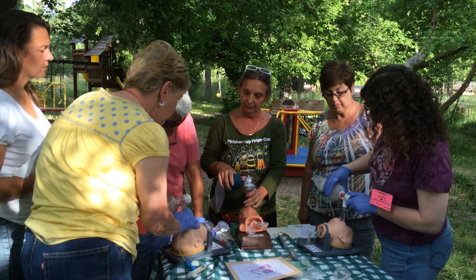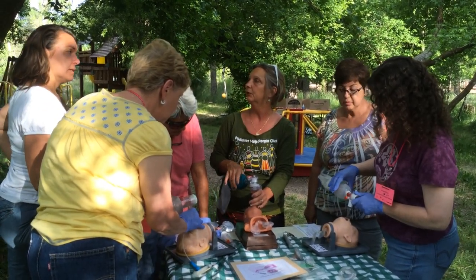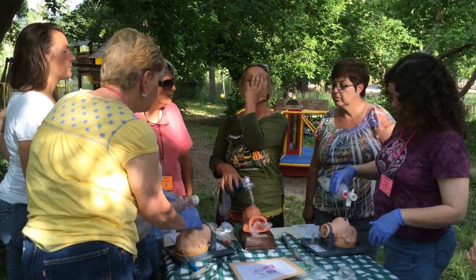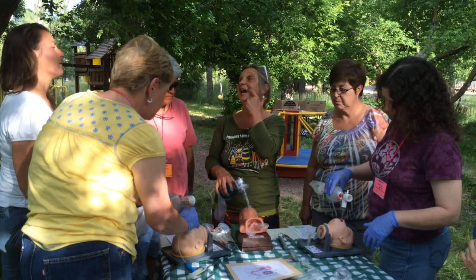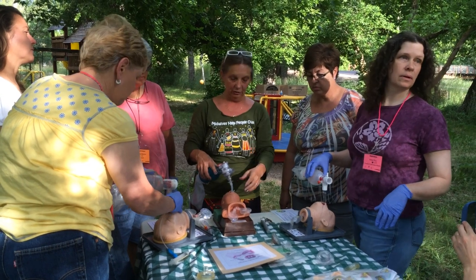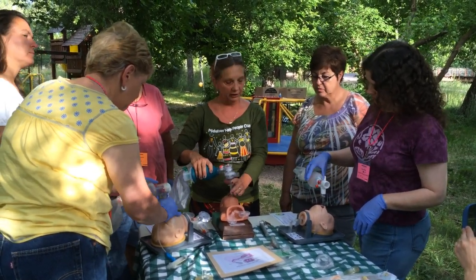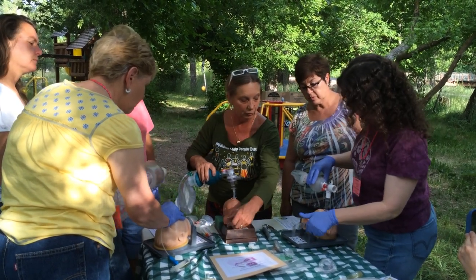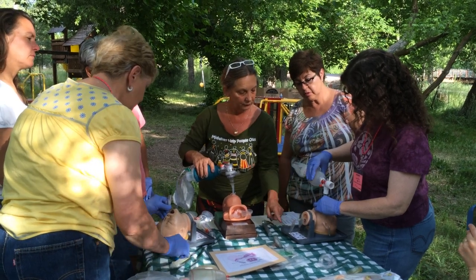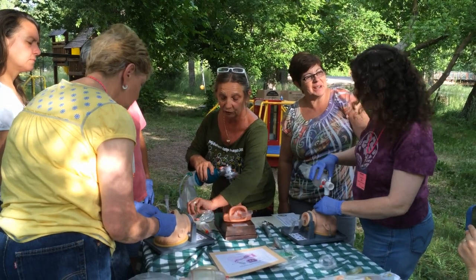You bag your baby. So the sole purpose of this is to prevent air from going into the stomach, and free up your hands. Have you ever tried to bag mask a baby and keep the mask on, keep the airway there, when you've got an NG tube? Plus, you don't have to worry about your seal as much. It's a real good seal. And you're going to get a lot better chest rise. So on these, you just need to see if they're moving at all. It's moving. They're not going to fill totally.